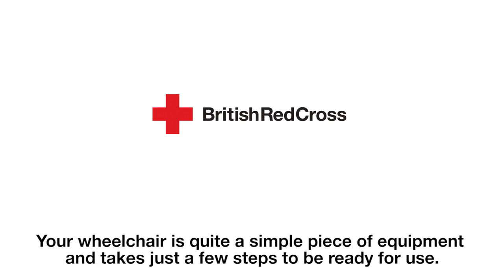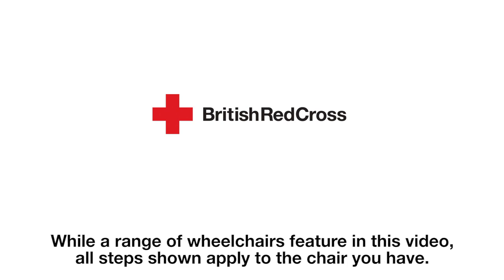Your wheelchair is quite a simple piece of equipment and takes just a few steps to be ready for use. While a range of wheelchairs feature in this video, all steps shown apply to the chair you have.